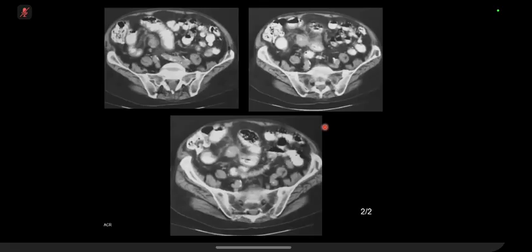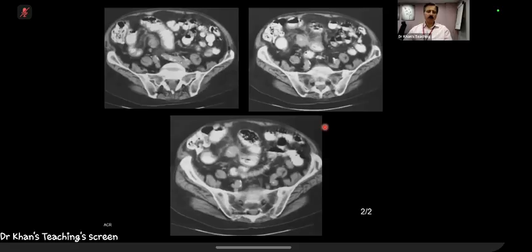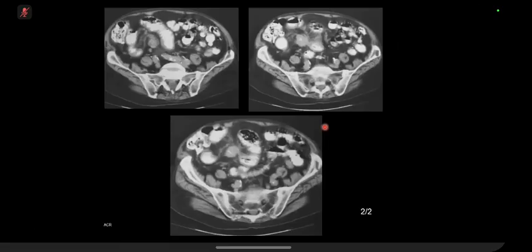It might be larger than the primary lesion. So the examiner can show you a mesenteric mass and ask where is the primary, and the primary might be more subtle in the small bowel. So that is the take-home point. Carcinoid, in 80% of cases, might show a bit of calcification.